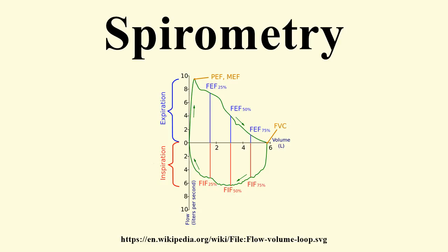Forced expiratory flow. Forced expiratory flow is the flow of air coming out of the lung during the middle portion of a forced expiration. It can be given at discrete times, generally defined by what fraction remains of the forced vital capacity. The usual intervals are 25%, 50% and 75%, or 25% and 50% of FVC. It can also be given as a mean of the flow during an interval, also generally delimited by when specific fractions remain of FVC, usually 25 to 75%.